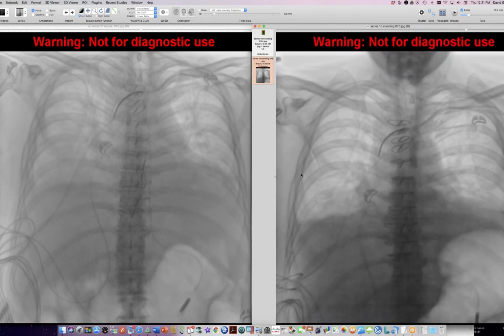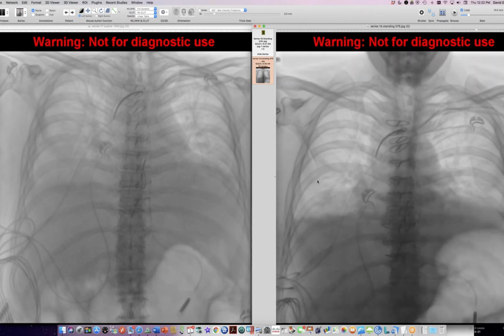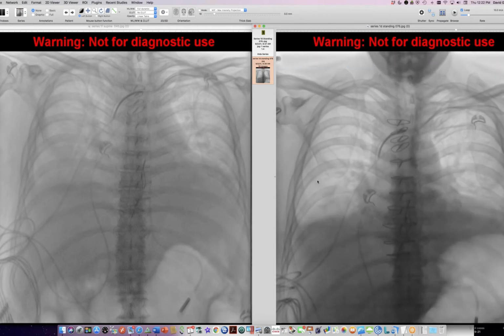When I asked the person to take in a deep breath, it turns out the person has had his abdominal muscles tense. He's actually pushed his diaphragm up by tightening his abdominal muscles. And then when I ask him to take in a breath, he relaxes his abdominal muscle, and the diaphragm is actually passively falling here. So what looks like propelled excursion, active excursion of the diaphragm, is actually just passive motion caused by this abdominal breathing.